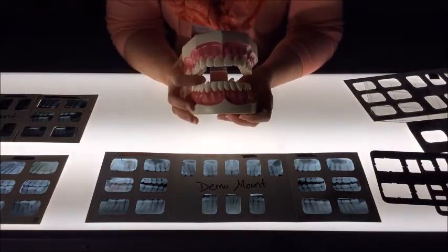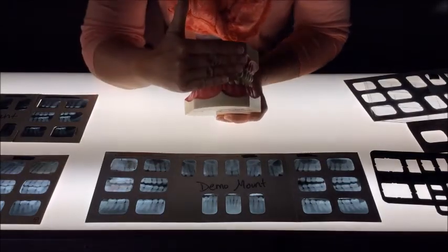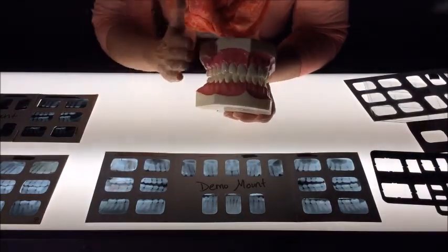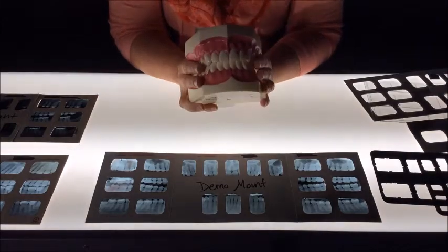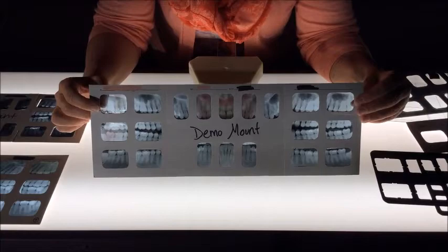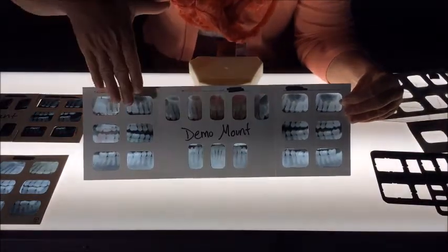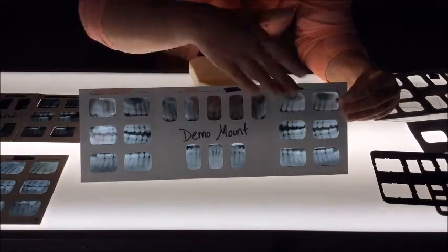Looking at this model, you will notice, if we review nomenclature, that in the front of the model we're presented with the anterior teeth, and the back of the model is the posterior teeth, similar to how a film mount would be set up.